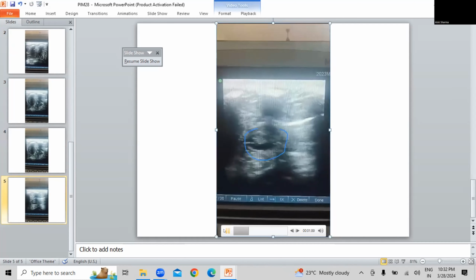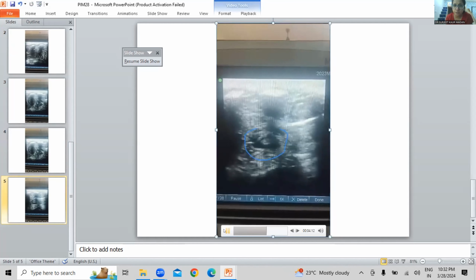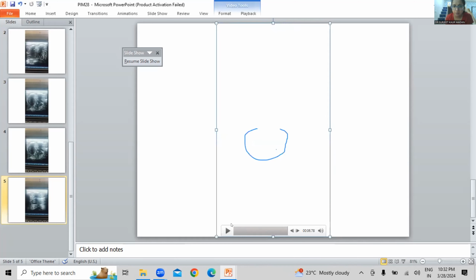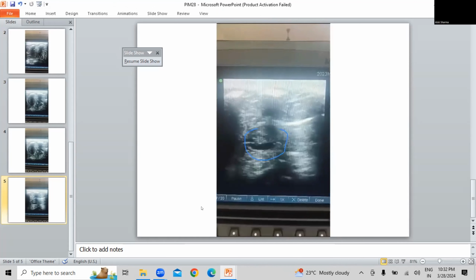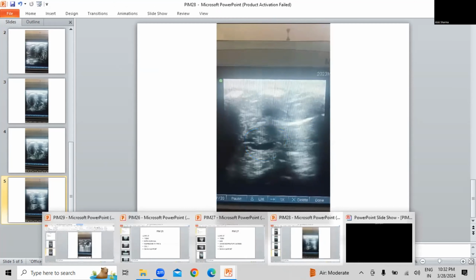Yeah, so this was a case of congenital diaphragmatic hernia. But in this area, I think I can see a bit of A lines. Sorry, I'll just wipe the rubber off. So there's a little bit of lung there.